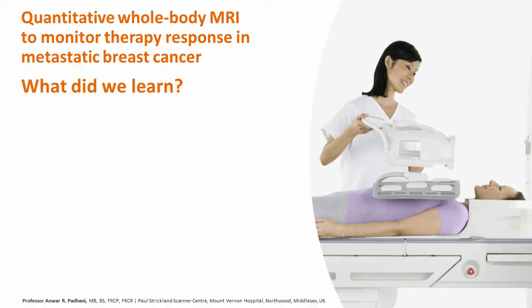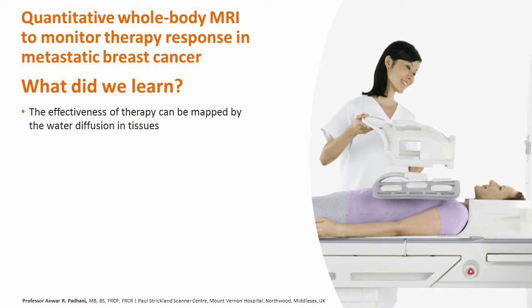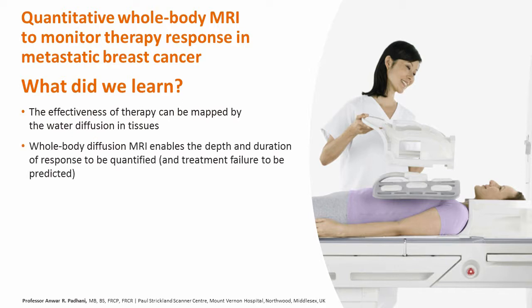So what have we learned? We have learned that the effectiveness of the therapy can be mapped using water diffusion in tissues. Quantitative whole-body MRI enables the extent of response to be quantified and treatment failure to be more accurately documented.